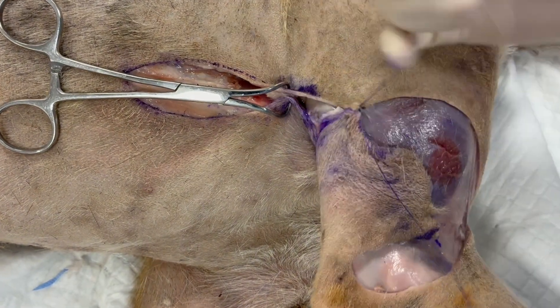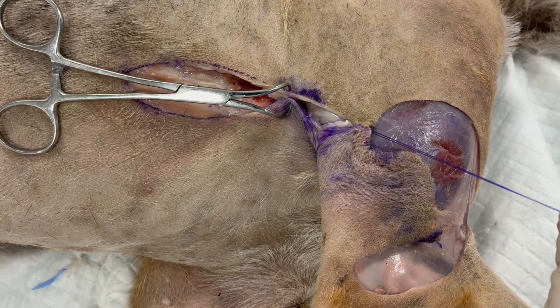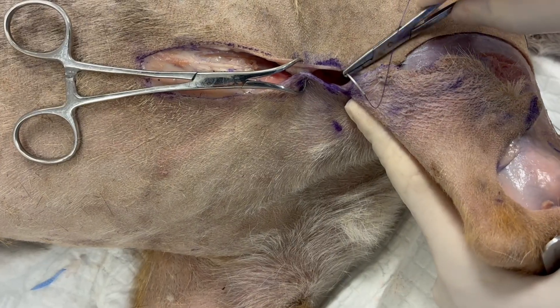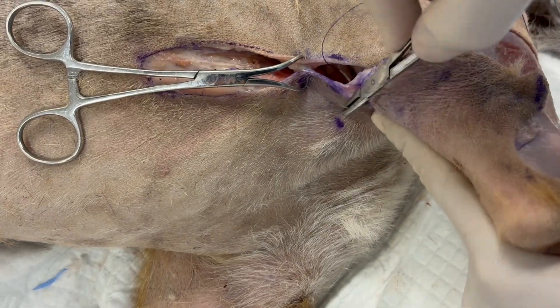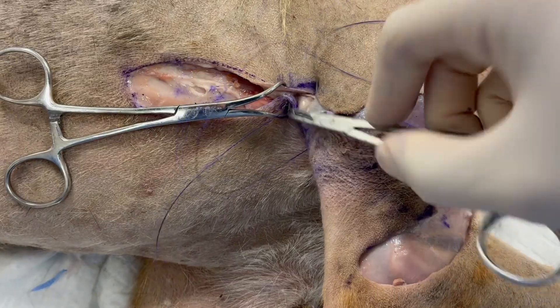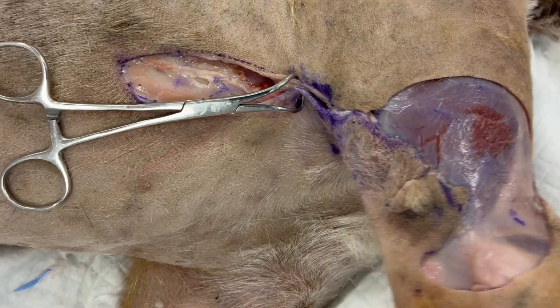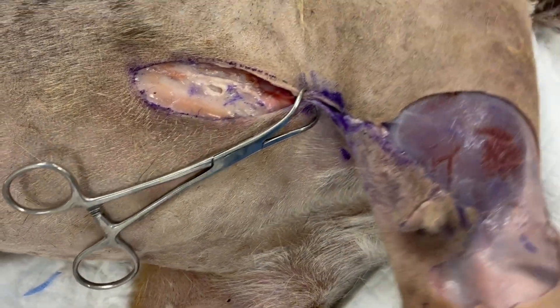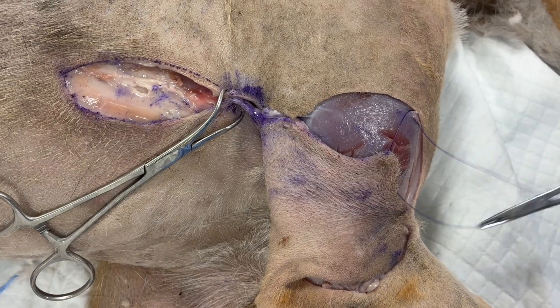Using a series of interrupted subcutaneous sutures we are going to pull that flap into place. Here are some deep interrupted subcutaneous sutures to pull that donor site together cranially. We are checking range of motion to make sure that the closure does not have any excessive tension.